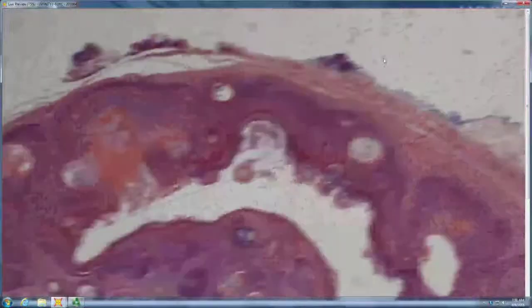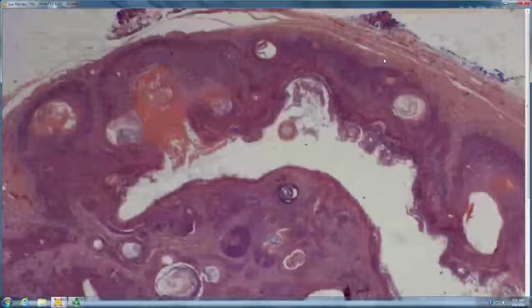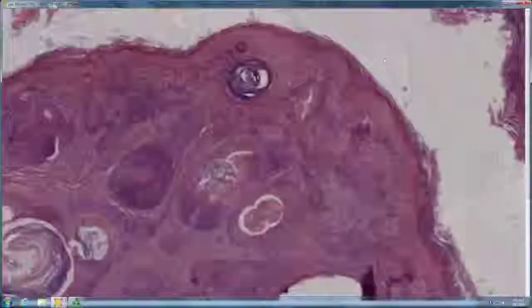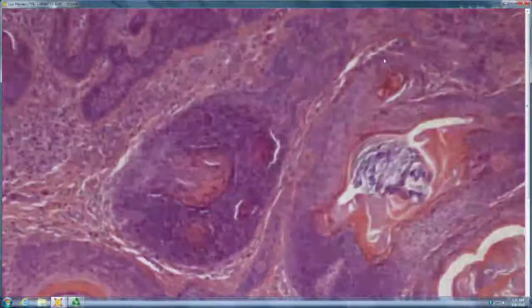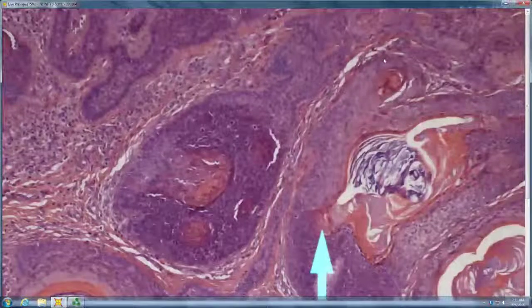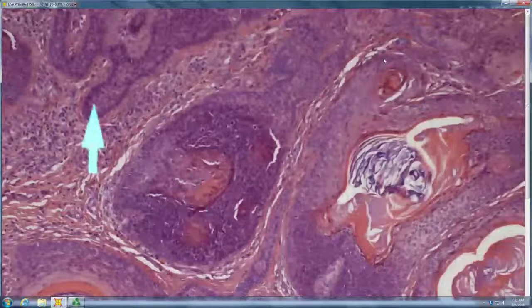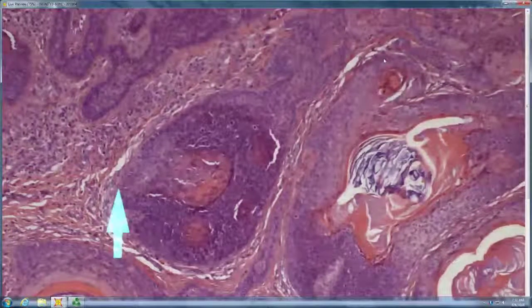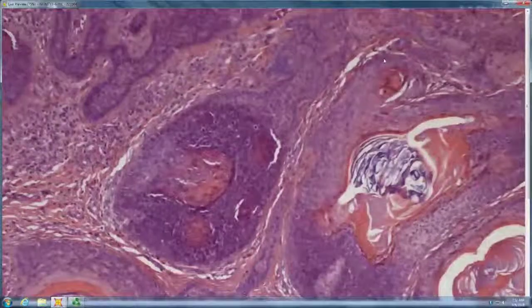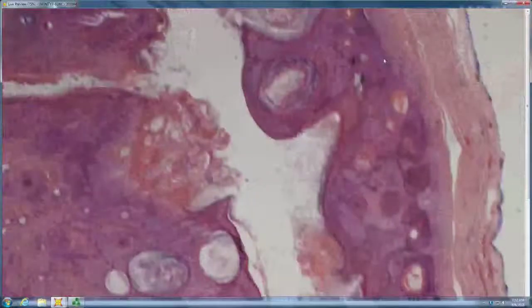So what's the overall configuration? Like an inner cyst, like a cyst, and then differentiation. Inner root sheath. So there's inner root sheath with trichohyalin, red trichohyalin granules. Yes. And there's clearly outer root sheath as well. So you are correct. It is a cystic panfolliculoma.